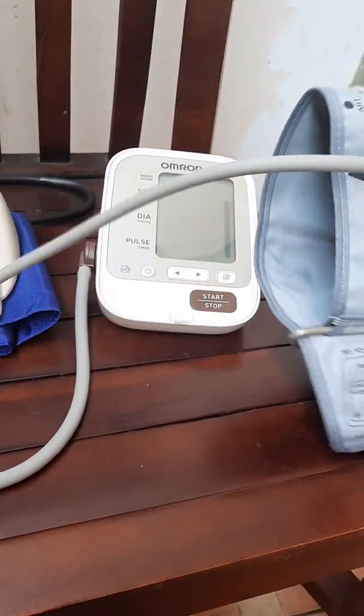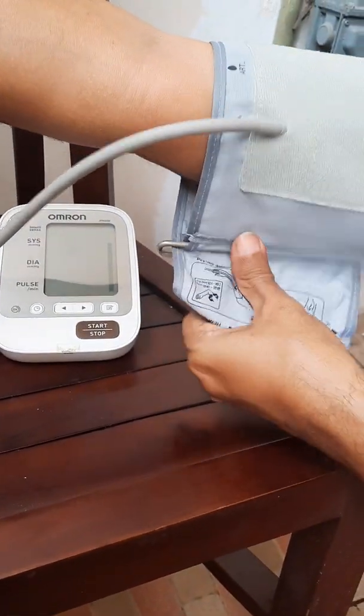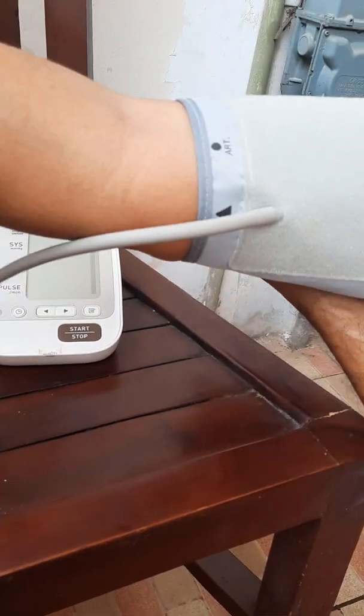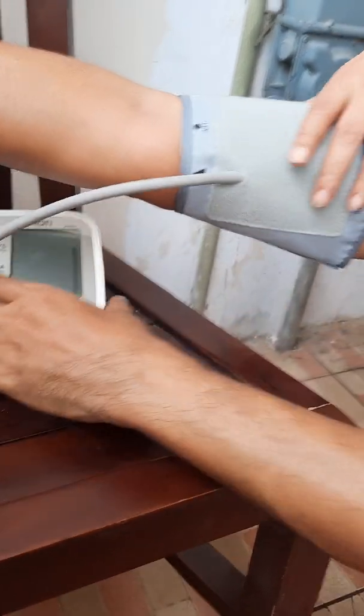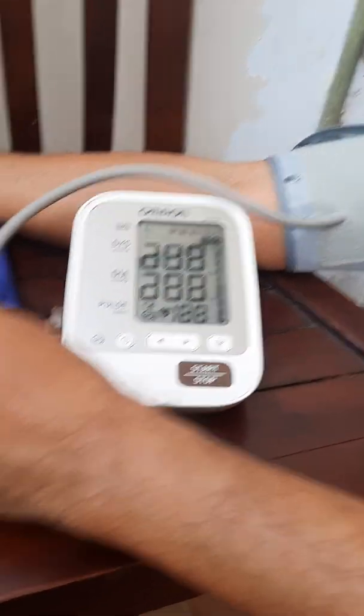Take a look — this is the artery point, just like that. And press start.